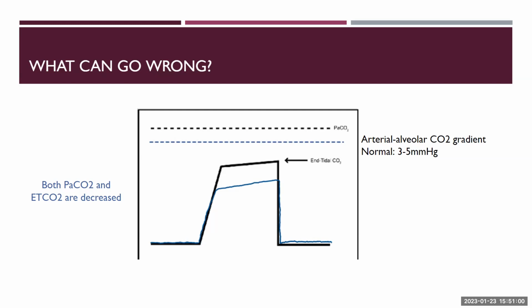But it's always important to do the mental exercise of trying to answer these questions, because it helps you conceptualize the idea that these two should correlate with each other fairly closely within a few breaths. So once one goes up, the EtCO2 goes up, it is the result of PCO2 going up. And once it comes down, it was the result of the PCO2 going down. Basically, you can use the EtCO2 to estimate PaCO2.